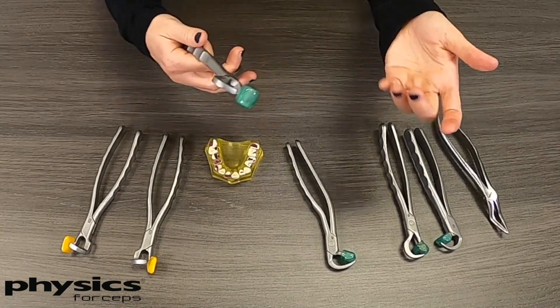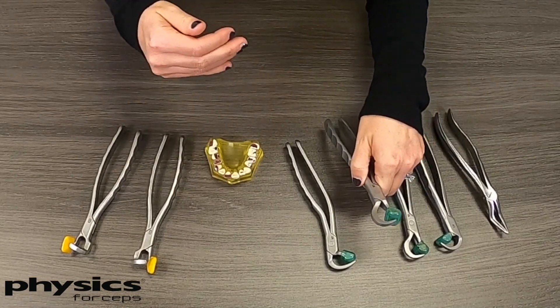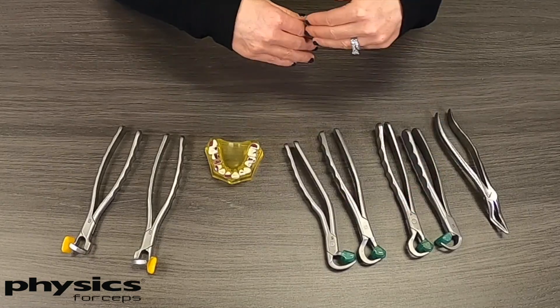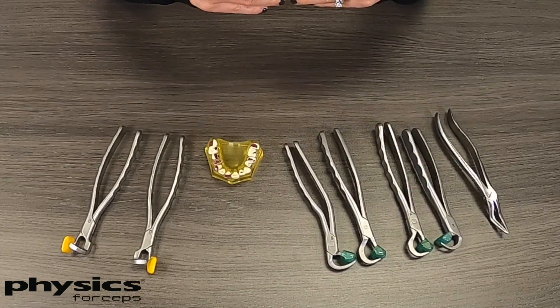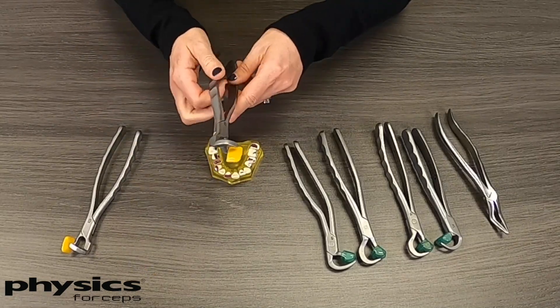Another commonly asked question is how these work when you get farther back in the patient's mouth. These four instruments will pretty much get back to your first molars. You may or may not be able to reach the second and third molars, depending on the cheek limitations of the patient.